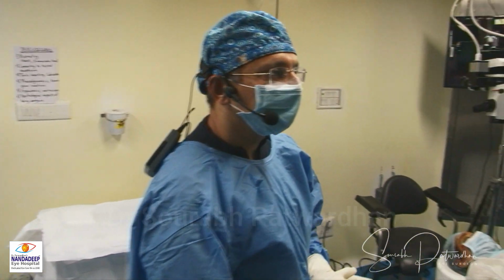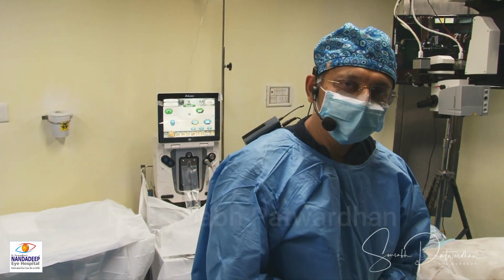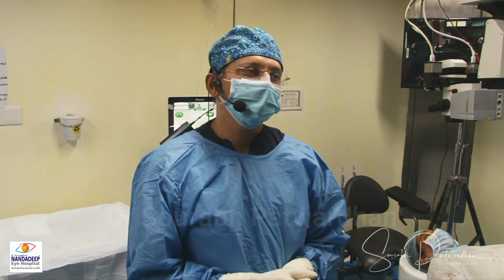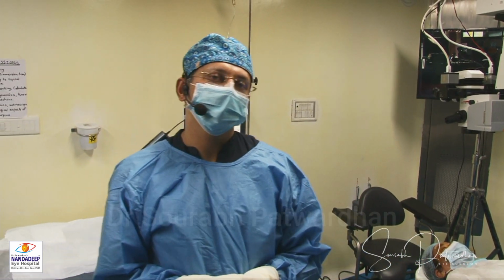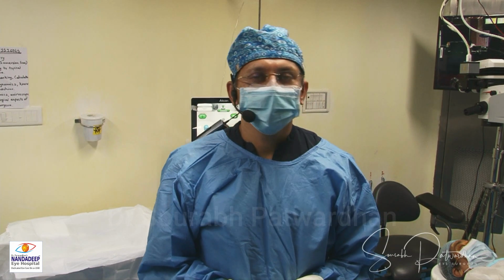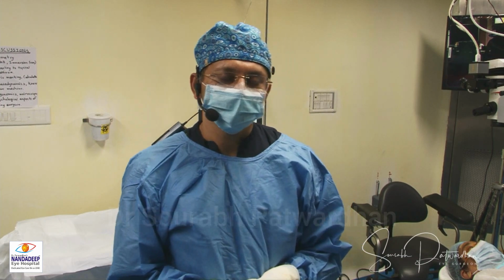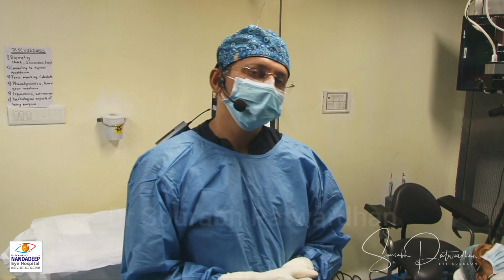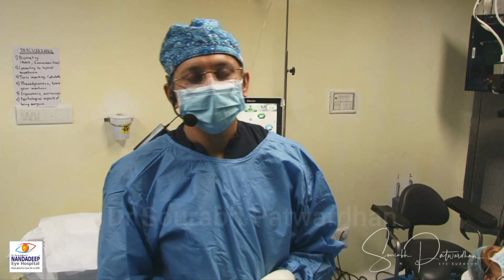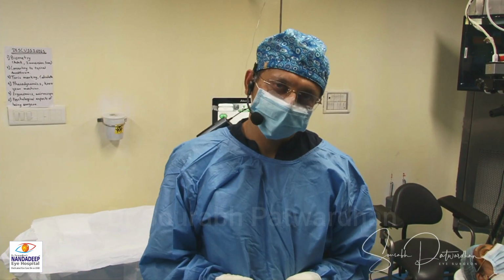Okay. So we already cleaned the patient. We are just waiting for the contact time to be over, and then we'll mark with the iToric Android app. For toric IOLs, nowadays it has become quite simple in terms of IOL calculation because of the Barrett toric calculator formula. It's quite accurate and very easy, and it's available online free of charge. Irrespective of whether you have the optical biometer or a device which has inbuilt Barrett, even if you have immersion A scan, you can calculate the IOL power by the Barrett formula online.